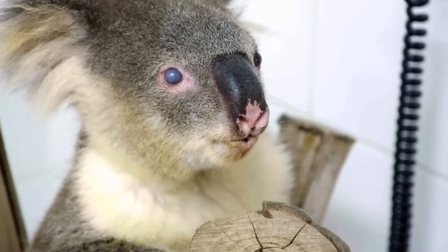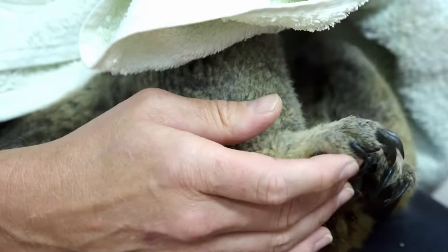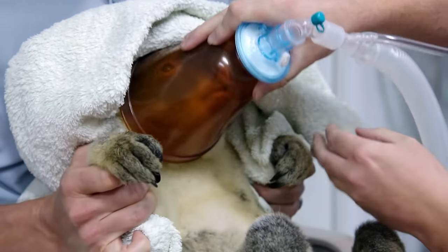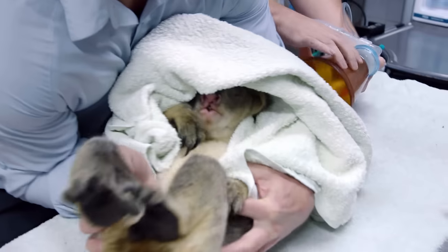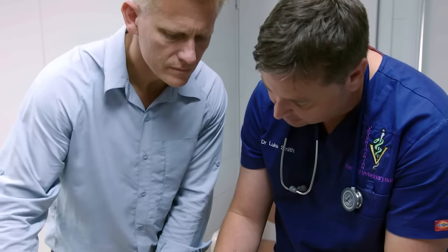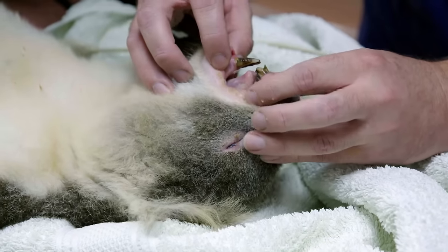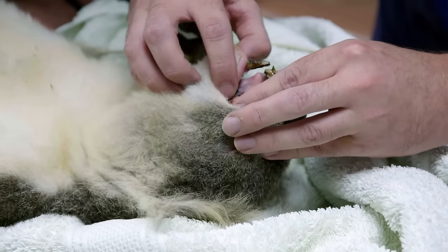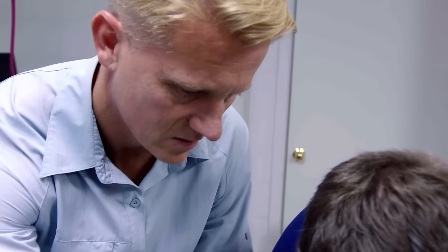Next, Monty goes under a general anaesthetic so the vets can take a close look at his mouth. Like an expectant mum. In order to examine Monty, we first need to give him an anaesthetic, so we gas him down. I kind of hold him like a baby, which is really quite nice. And once he's nicely anaesthetised, we can then get to grips with his physical exam. He's got quite a lot of wear in his front two teeth there. So he's an old boy. Yeah, so that area of gingivitis there is abnormal. Mm. So, I mean, there's definitely a hole there, a massive hole.